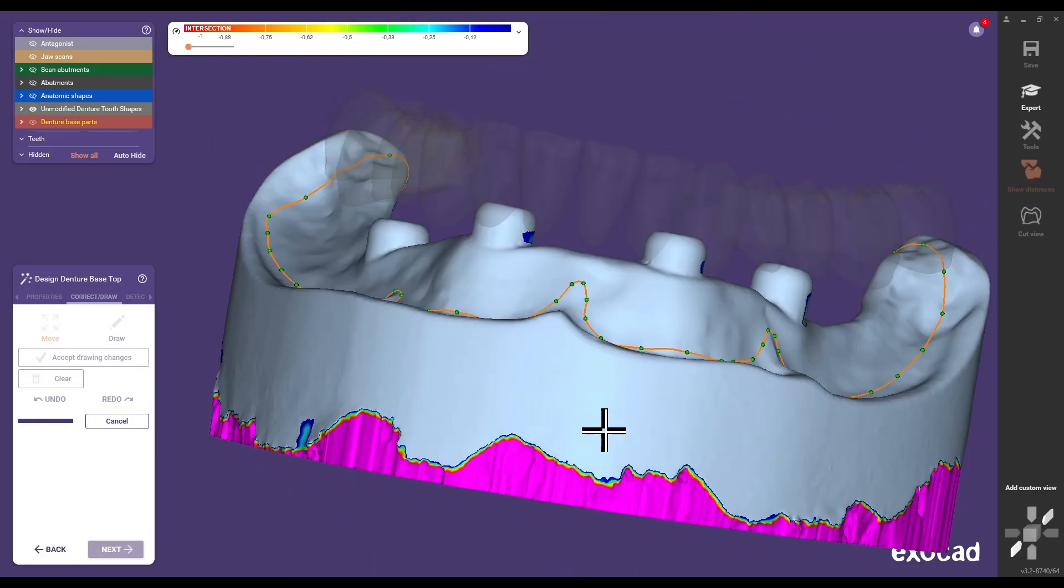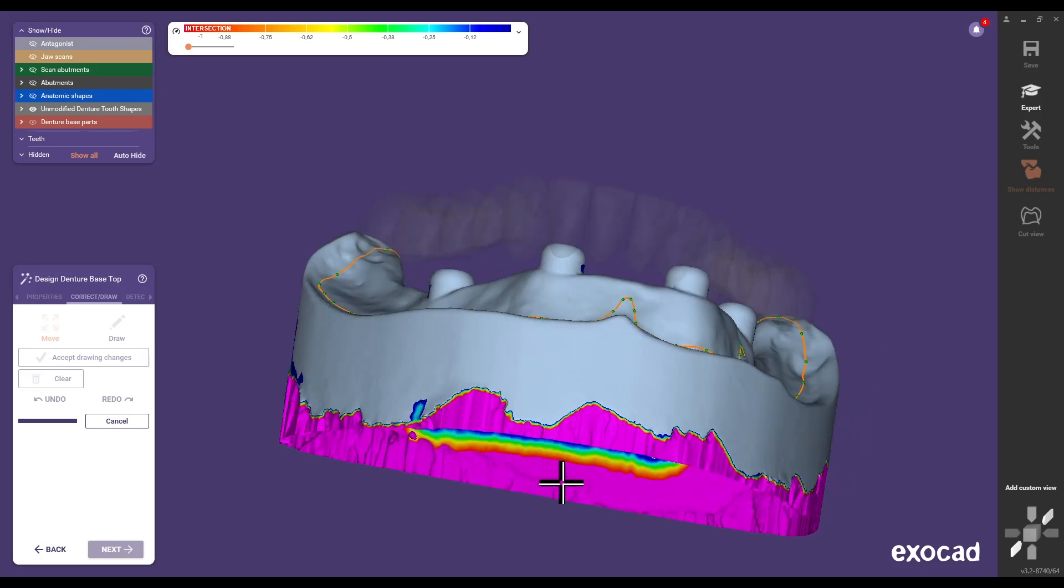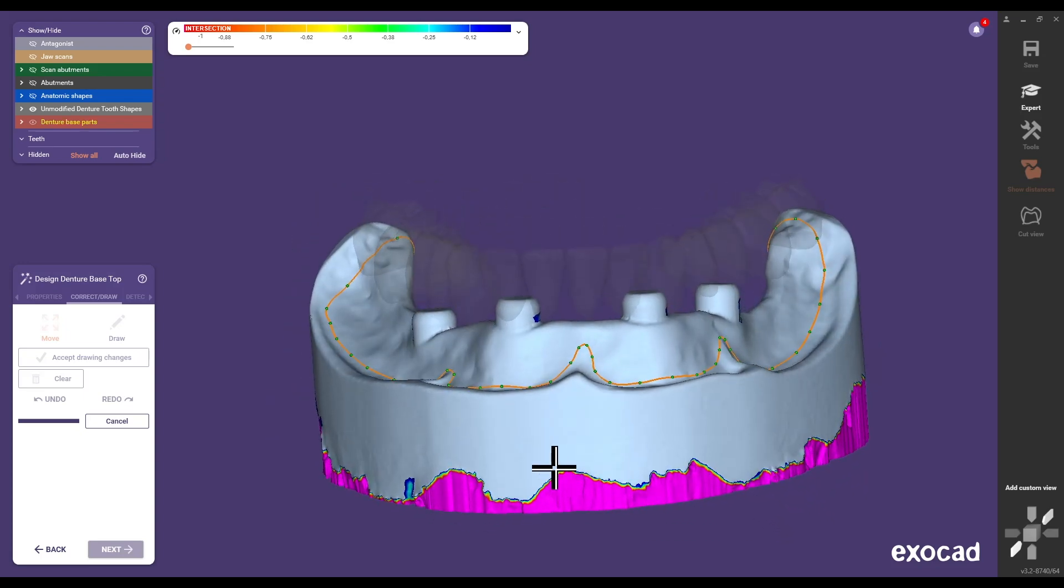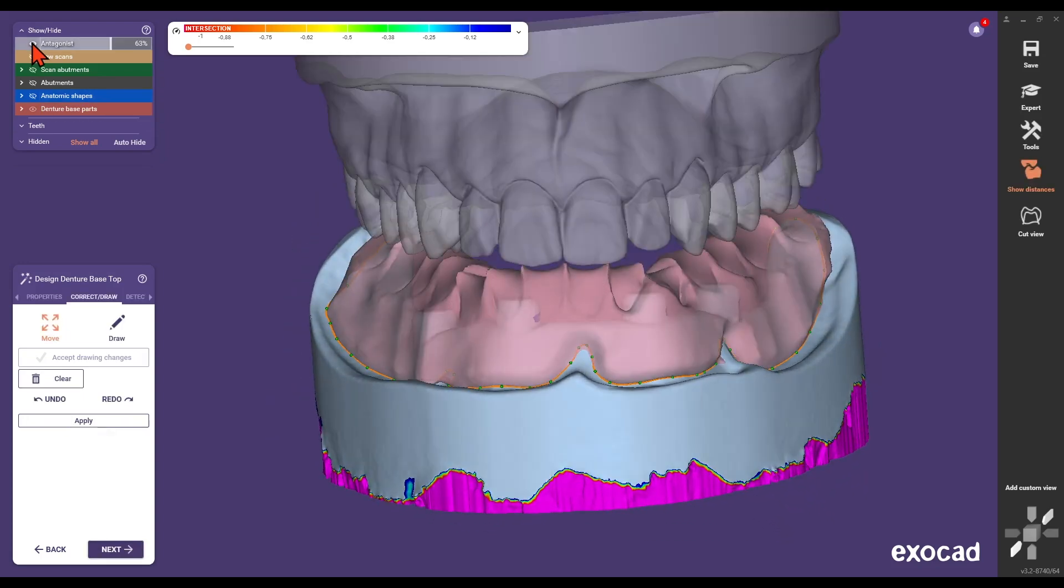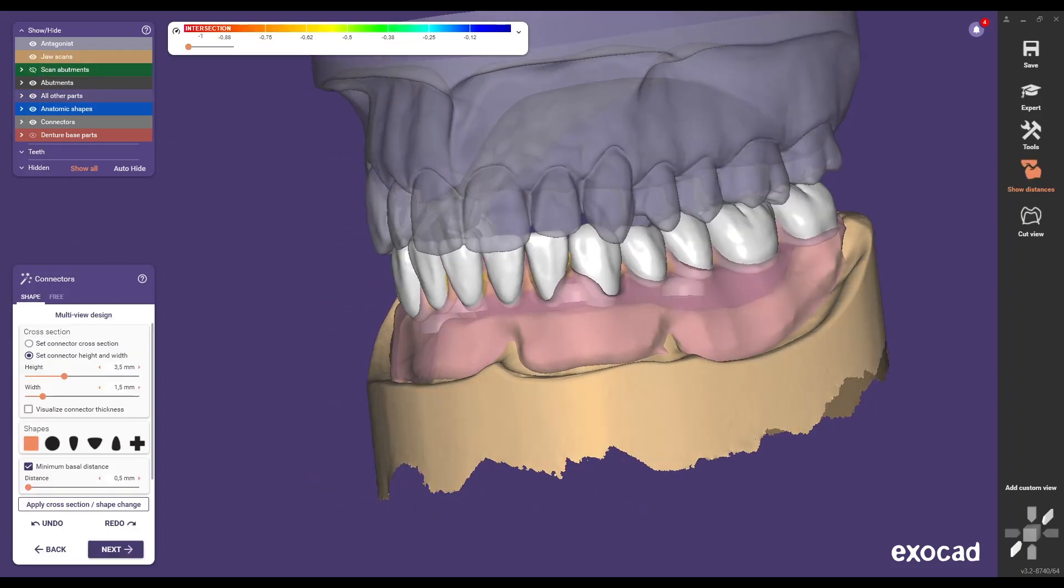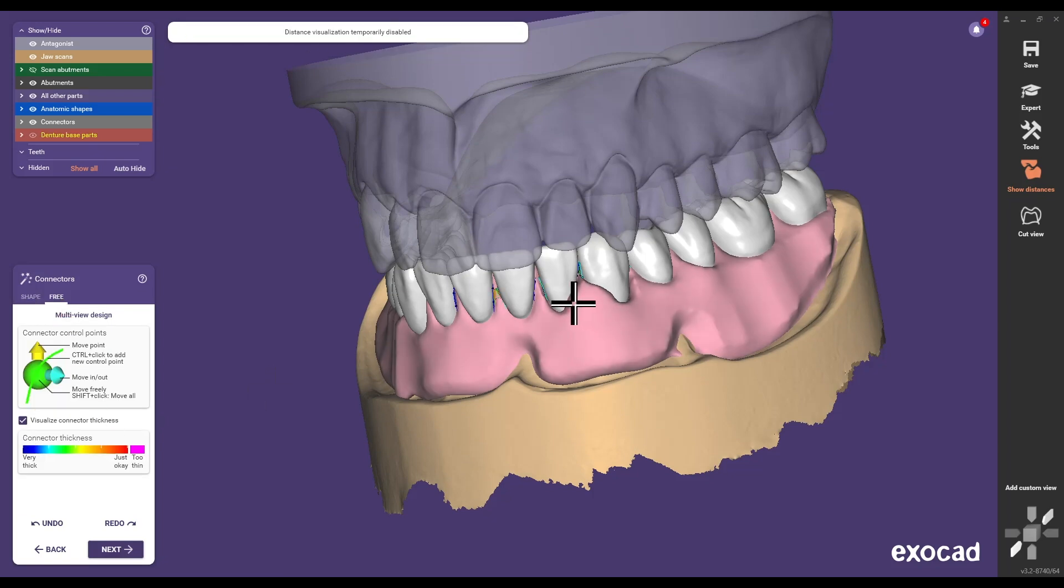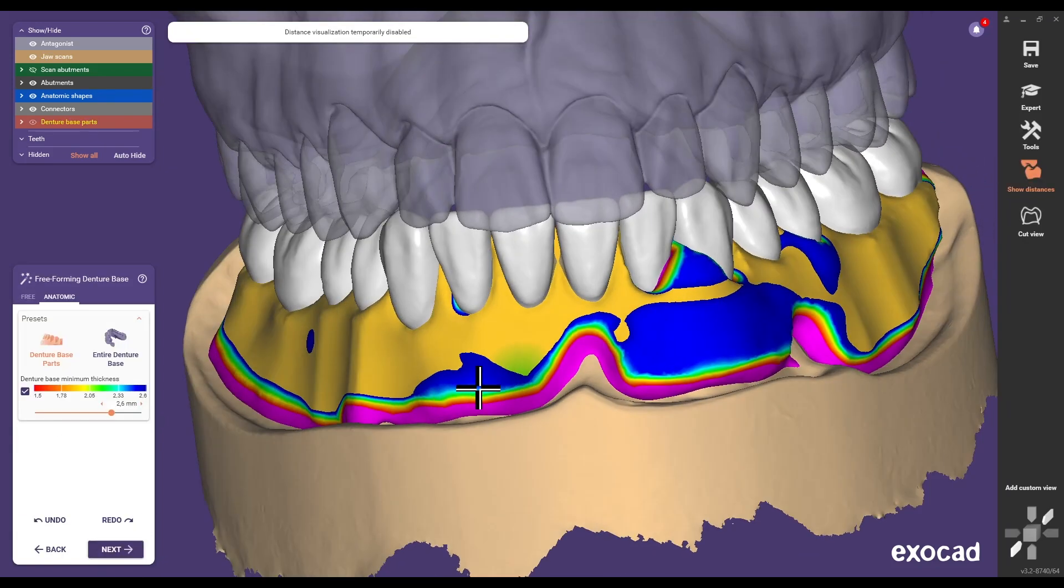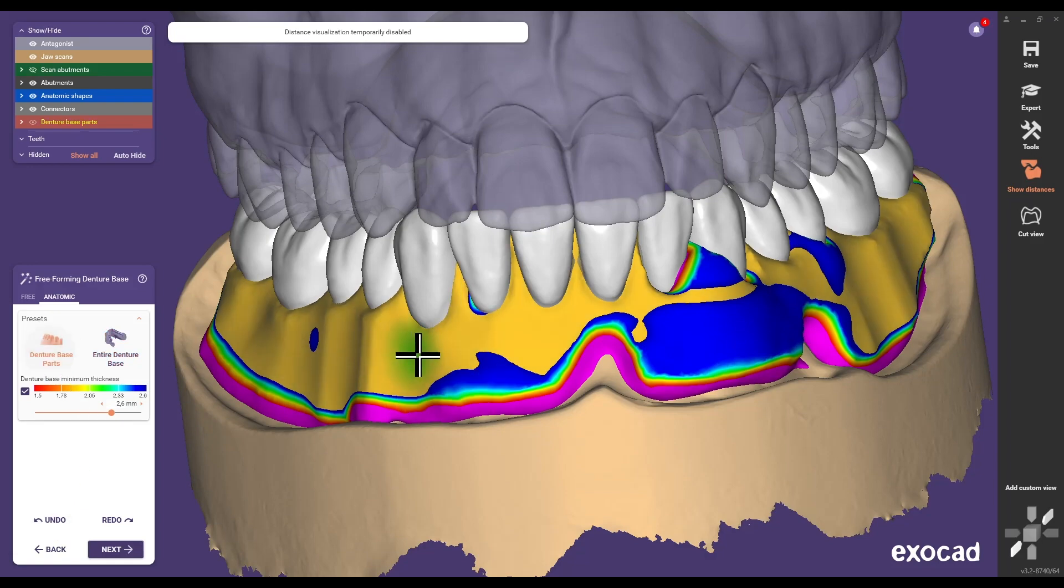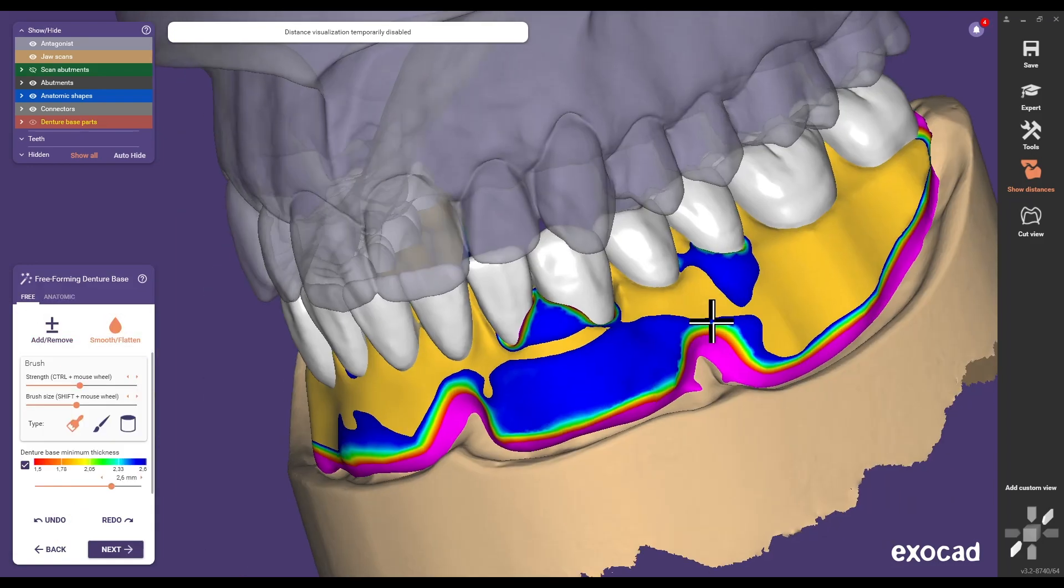Before merging the Gingiva base and the teeth, modify the connectors between individual teeth as necessary. Confirm the connectors and finalize the surface of the Gingiva base by adding, removing, or smoothing as needed.